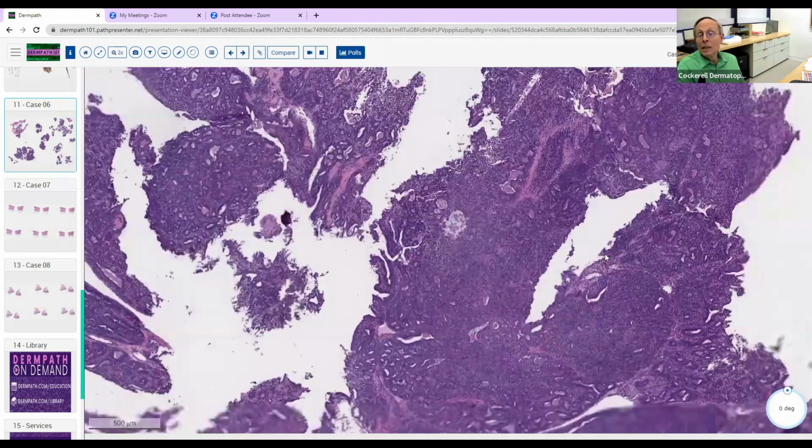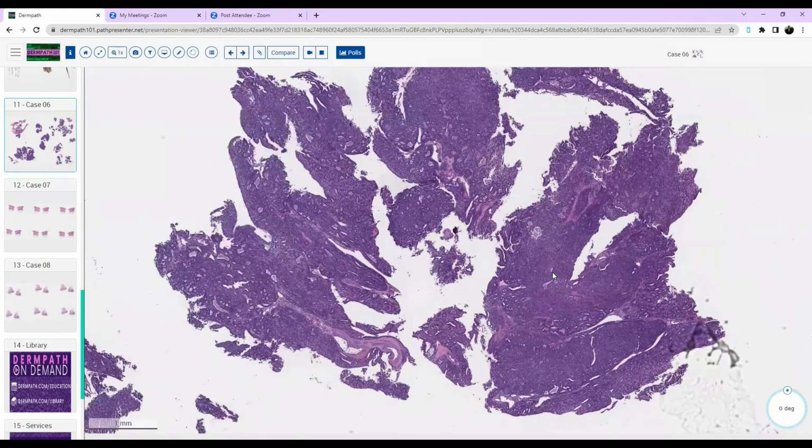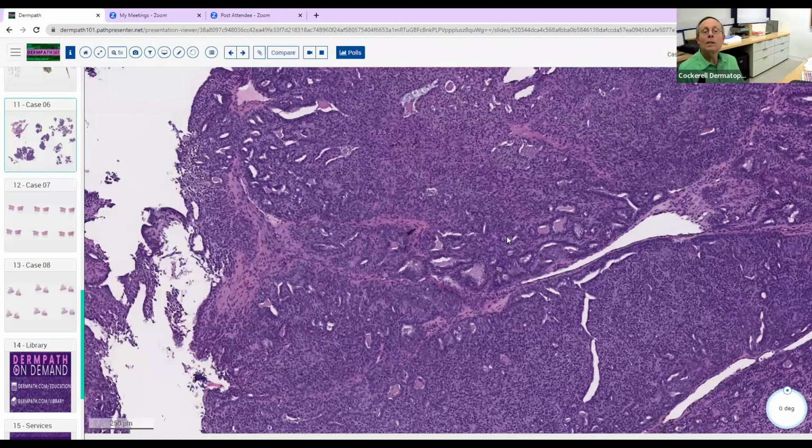So here, the malignancy is largely because of the large size. We can't really assess the symmetry or the circumscription. It seems like it's probably poorly circumscribed. So yes, most likely malignant. So what's your diagnosis in this case? Given its location and that it's likely malignant, this could be something you have to rule out, a digital papillary adenocarcinoma. Good. This is exactly what this is.